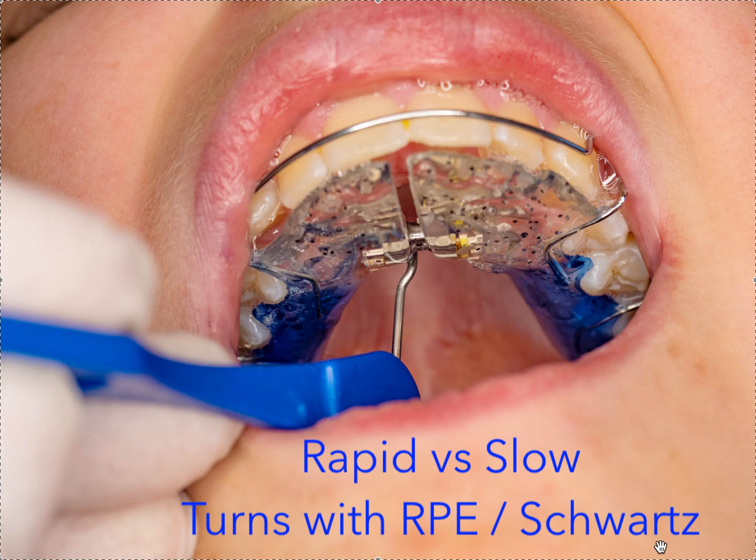So you, as the doctor and as the staff, need to be responsible to make sure your expander patient does not ghost you, okay? When you deliver the expander, it's kind of like placing a bonded retainer. You're married to that patient now. I don't care if it's fixed or removable. You need to make sure they come in a month. I don't care if your power went out, if there's COVID, you can do a virtual appointment. You are responsible for making sure they come in, and I can't say that enough.